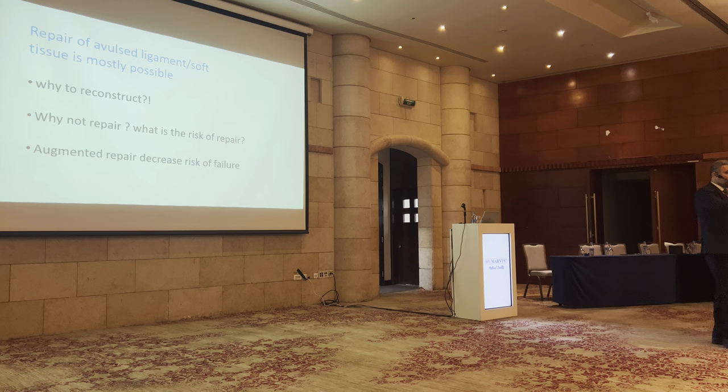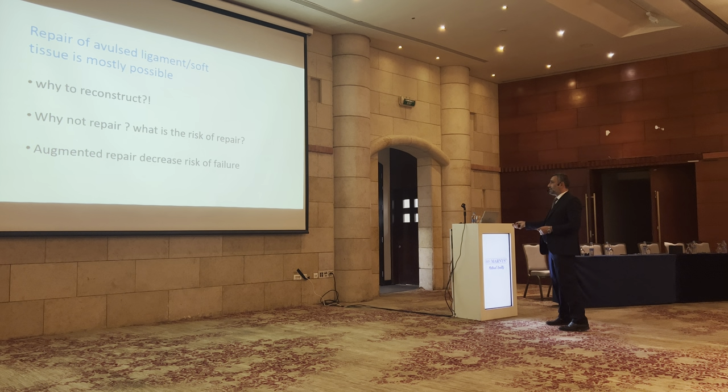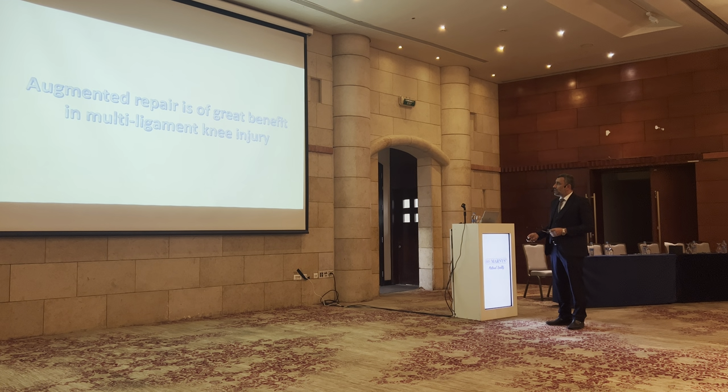So the stress would be on the synthetic material or on the graft. Let's take this case. This is how we use it. You do the repair and you pass it across, either by fiber tape or by graft, autograft. So the augmented repair is of great benefit in multi-ligament injury. Let's take this case.